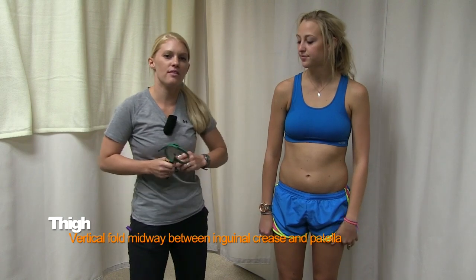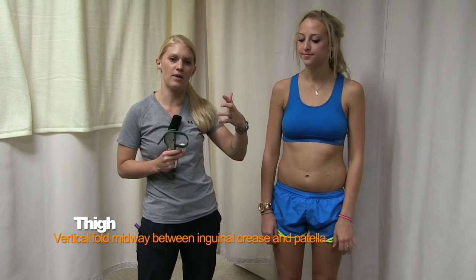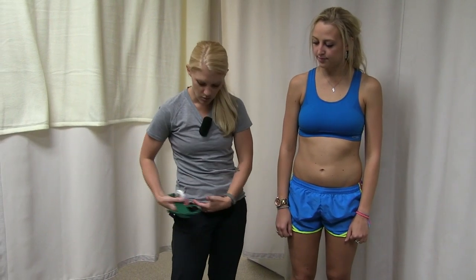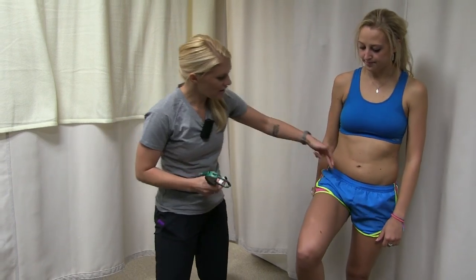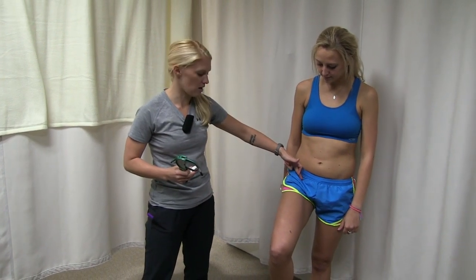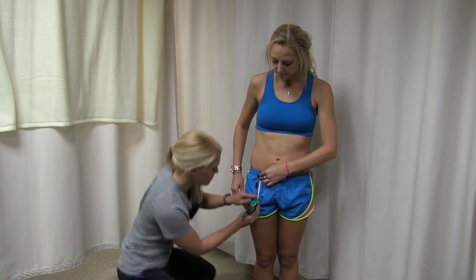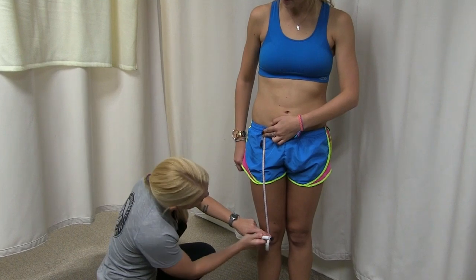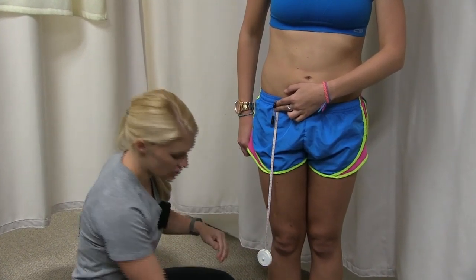For the last measurement, the thigh, we physically locate the halfway point because it's a larger area. It's on the subject's right thigh, halfway between the inguinal crease — the groin — and the top of the patella, the kneecap. Have the subject lift their leg slightly to find the inguinal crease, then put it down and hold the measuring tape. We found 44 centimeters, so the halfway point is 22. Mark it — you only need to measure once, no need to remeasure on the second or third attempt.